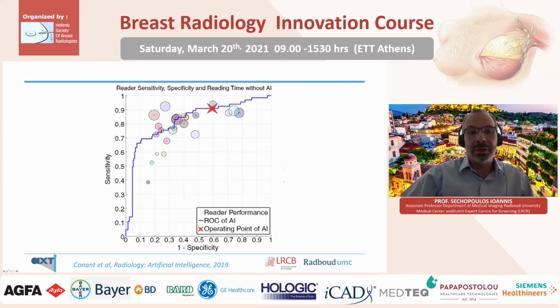So if we incorporate that, then we would have only half human single or hybrid reading of MLO DBT slabs, and that would help us achieve the same number of images to be read per case on average between mammography and tomosynthesis. And I ran out of those 15 minutes. I had to propose all these options.